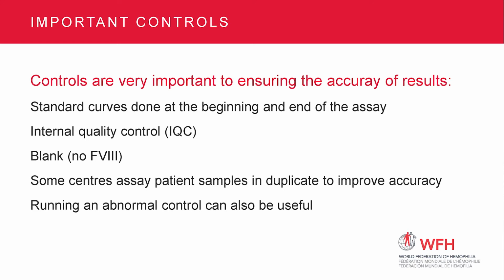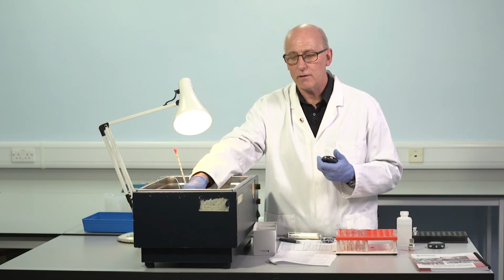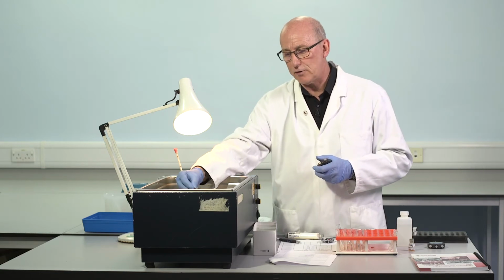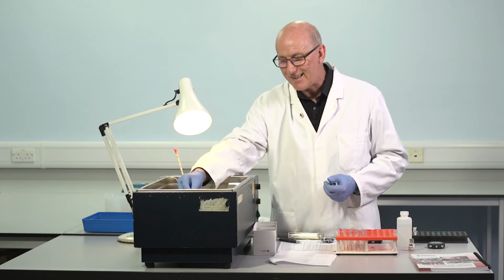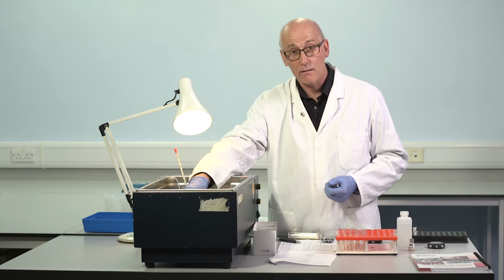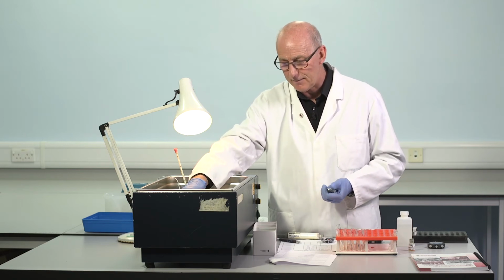And because we run a standard at the end, as long as those clotting times are very similar to the clotting times at the beginning, we can safely assume that the assay conditions have stayed constant during the time of that assay. We don't expect to see identical clotting times, but we hope to see very similar clotting times at the end. And it's an important question in order to confirm the validity of the assay.